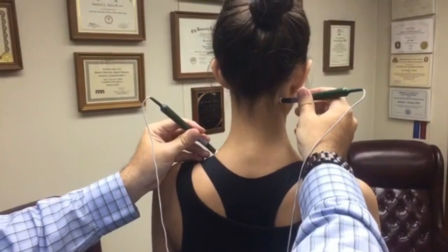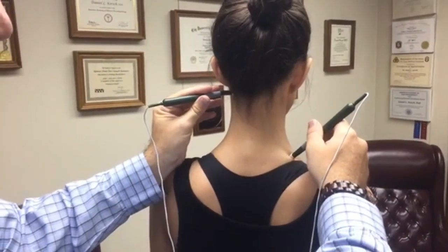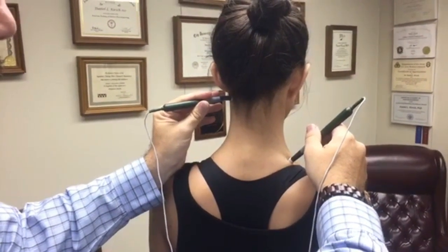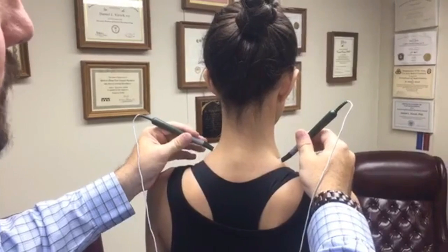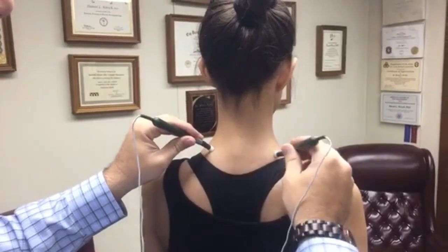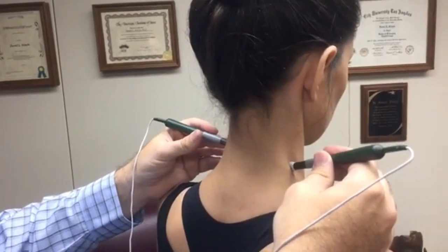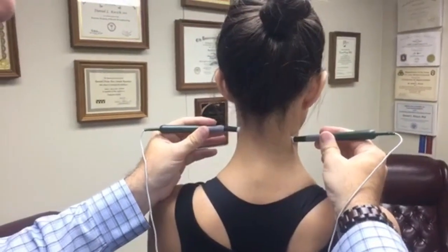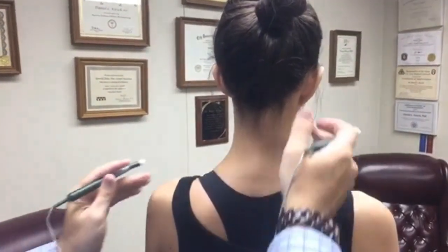We didn't ask Rachel where her hypothetical pain was, but we're saying it's cervical pain, so we're treating the entire neck. We make an X right through the neck. Just because of the location, we're already going across the midline, so that step is kind of built in. We'll do a couple of X's through the neck, then walk the probes up her neck — ten seconds at a time — staying in the midline. If you're around the back, the current stays on the surface and won't actually penetrate through the muscles.